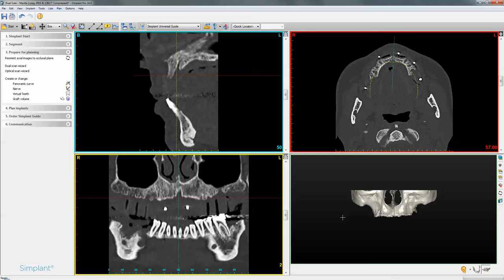Once you've opened the patient scan, you need to segment the upper arch. If you do not know how to segment the upper arch, please view the video tutorials on basic segmentations on edentulous cases. Once you've segmented the arch, go to 'Prepare for Planning' and click on the Dual Scan Wizard.